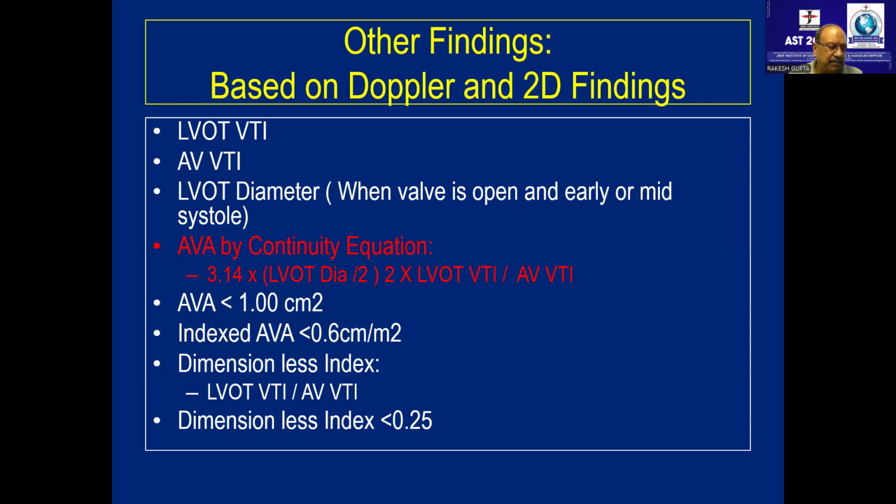I've got a problem. Where is the cursor on LVOT and AV VTI? Wonderful. Sir, same question, sir. Where do you put the cursor? Are you comfortable with this? I'll stop this presentation. I'll go somewhere else now.